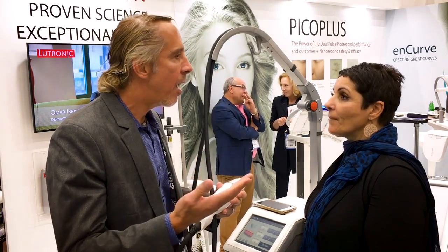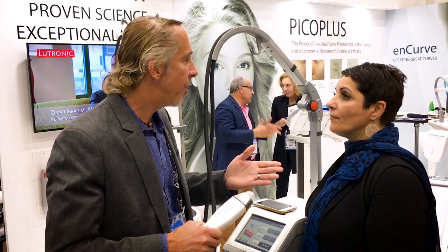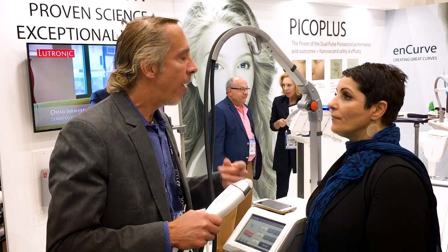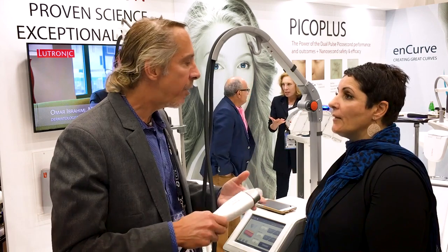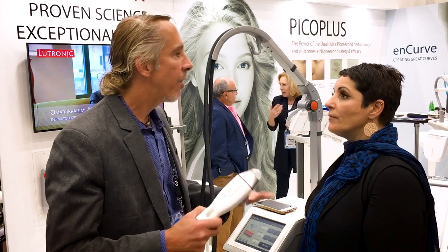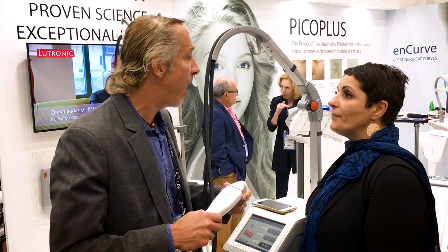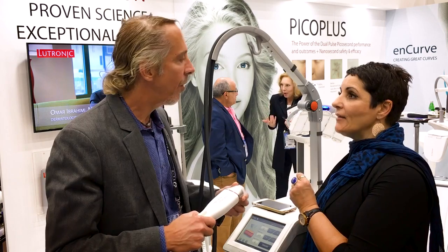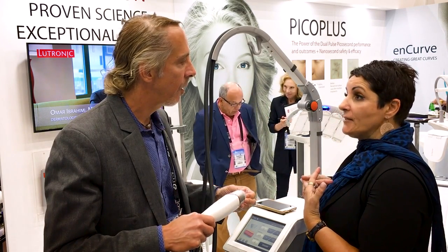Right. There's a Fitzpatrick scale, types 4, 5, and 6. So Asian skin and African American skin are at risk with devices that don't protect the skin. But this was developed in Korea, so it's tuned to even the darker skinned Asian patients. Of course, because they have light skin all the way through to dark skin. Exactly.